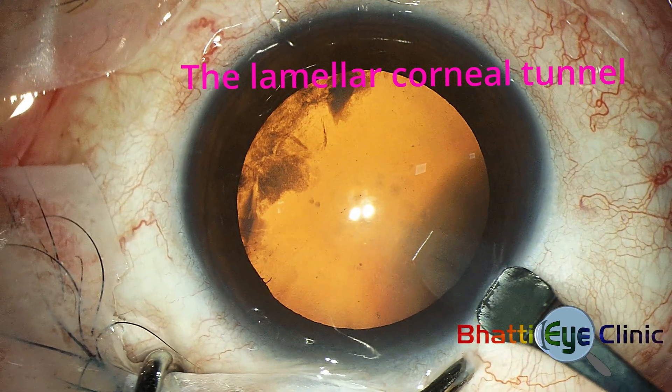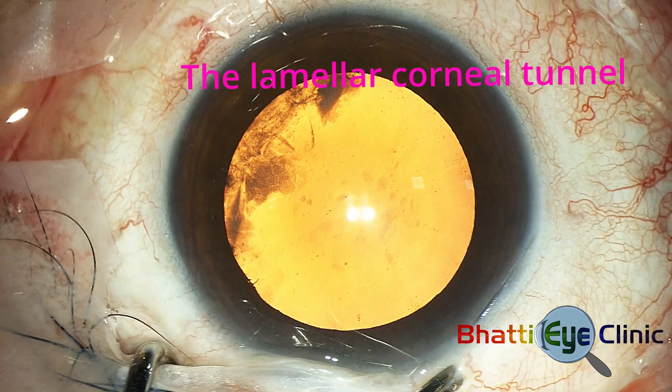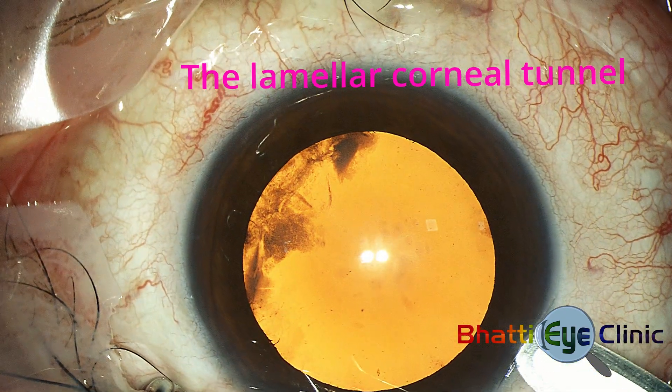The first step in phacoemulsification is the creation of a lamellar corneal tunnel with a bevel-up tunnel blade.